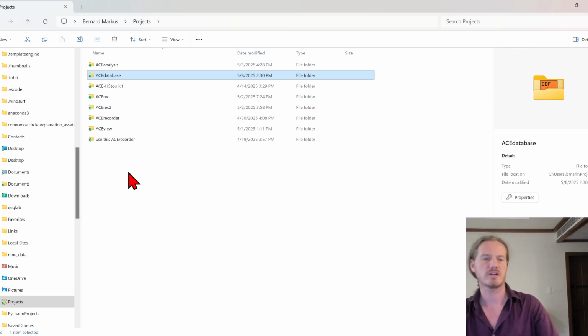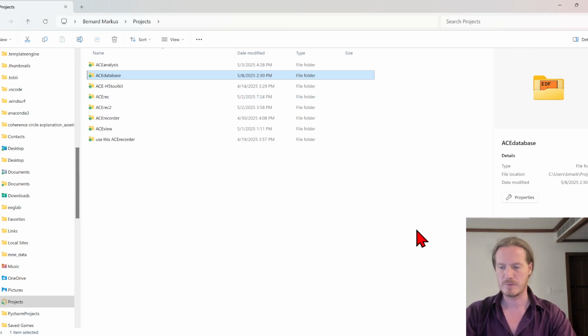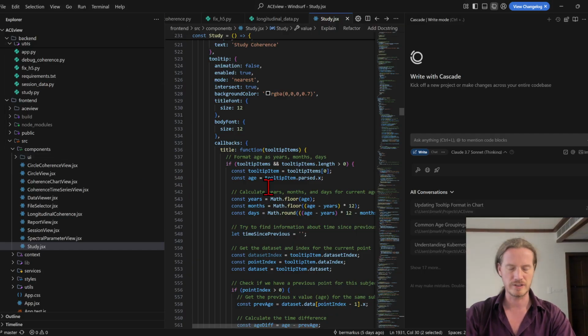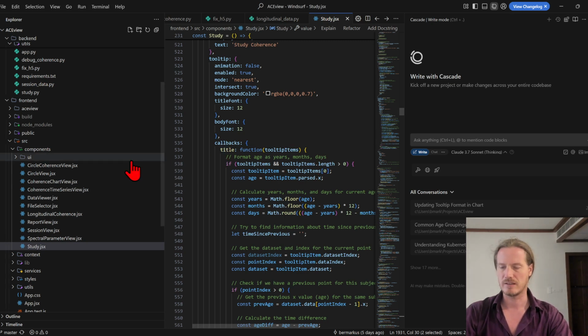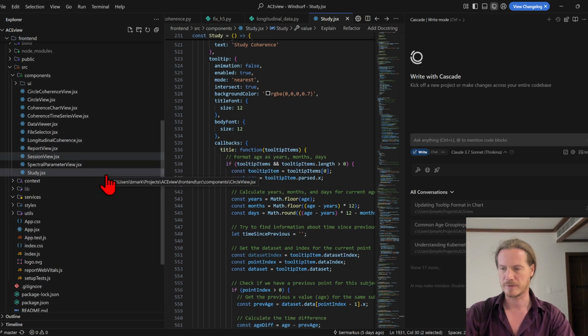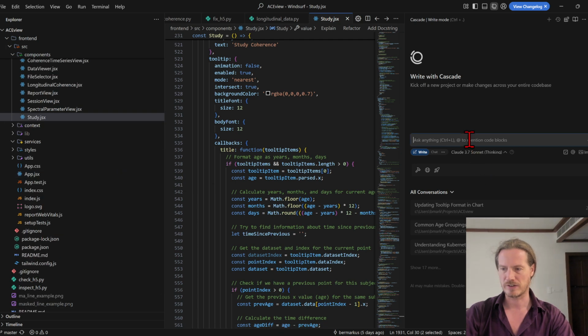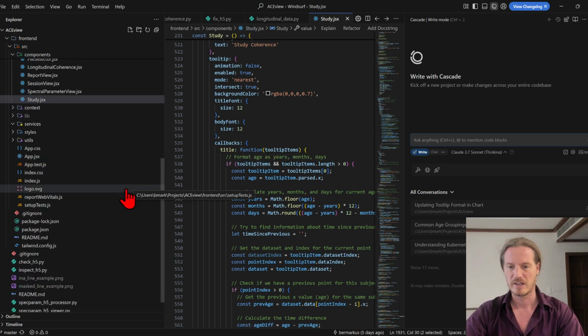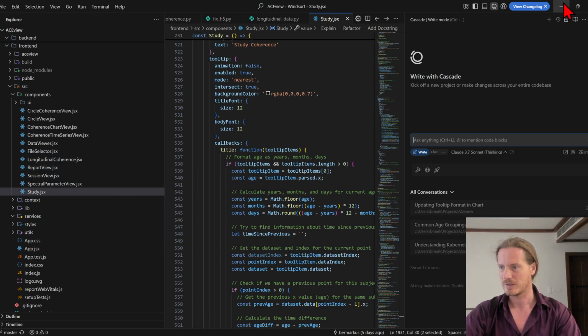So we go back to the screen view, and basically at the moment there are 5 applications that I've been building over the last half year with the help of AI. And AI here is fully integrated in a software development environment now. And it's basically a matter of asking here something that we want to change, and it will, because I'm not a programmer. All of these programs I've built purely with AI. It's called vibe coding, where you don't know how to code, but the AI does it for you, and you just kind of keep tweaking it and asking it to make changes and testing it until it works.